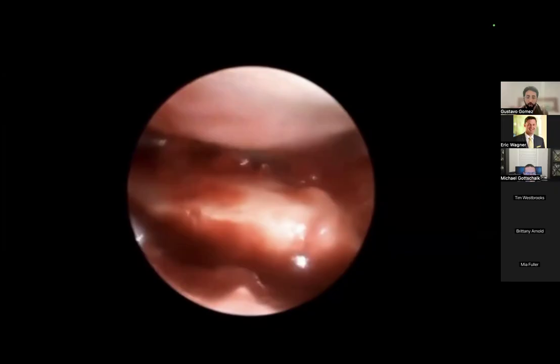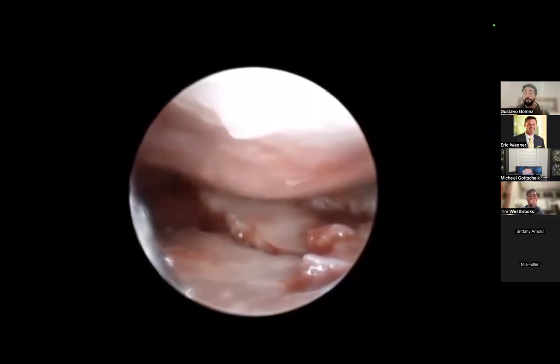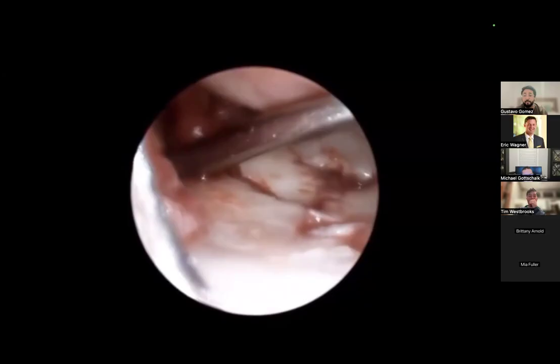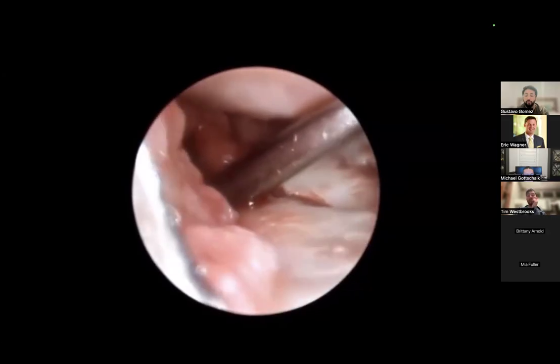It's impossible to identify and treat this kind of rotation of the fragment just under image intensifier, because you cannot see where the cartilage is looking, because the image intensifier doesn't show us this kind of information. So in these cases, for me, it's very important to do arthroscopy. And then we can check the stability of the rest of the articular surface. It's impossible not only to see, but also to solve these kinds of problems without arthroscopy.